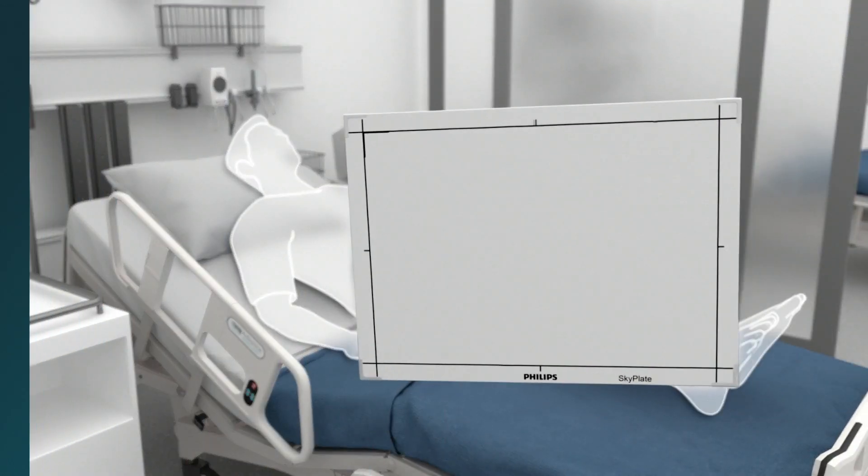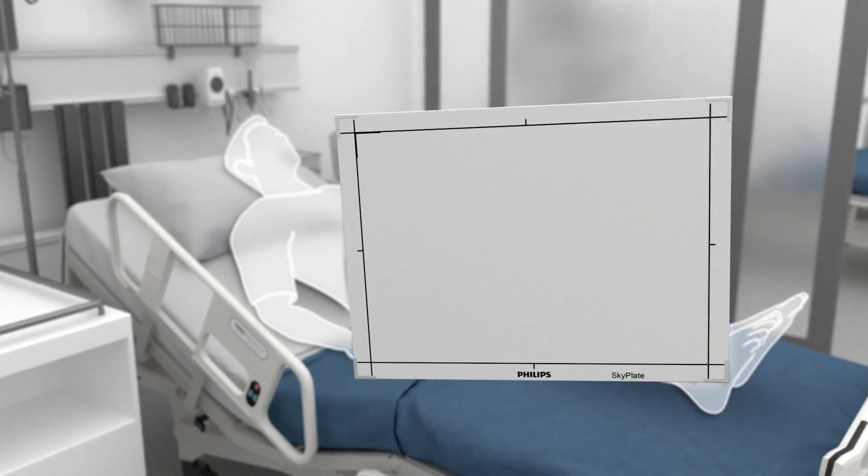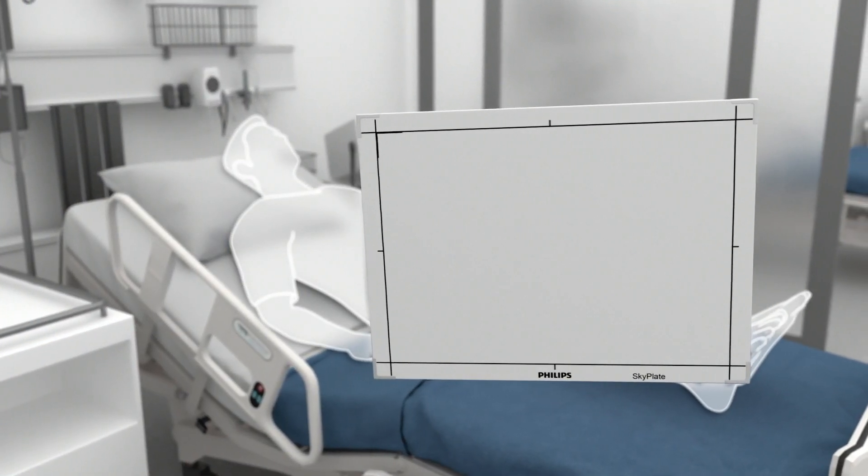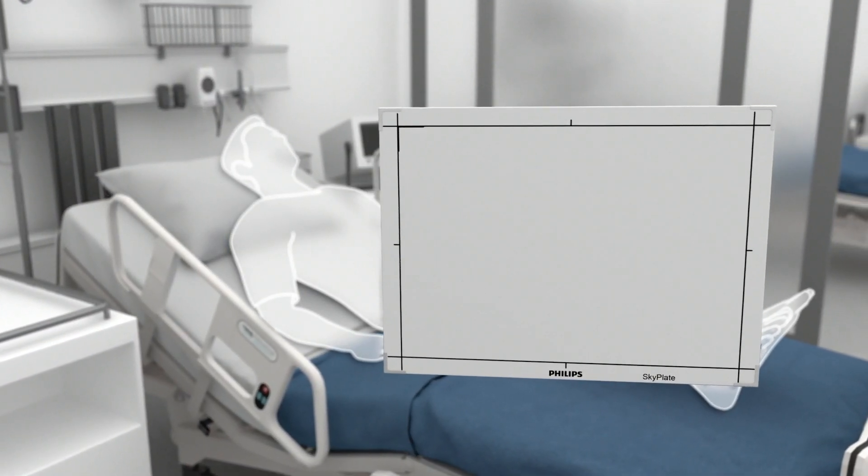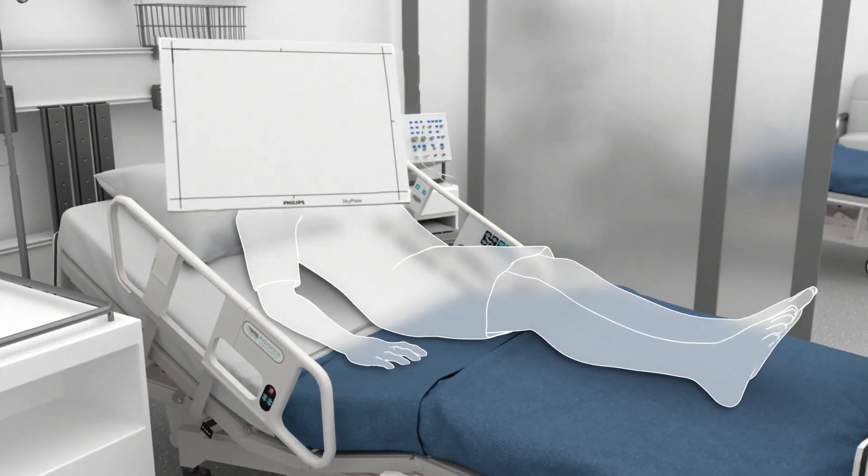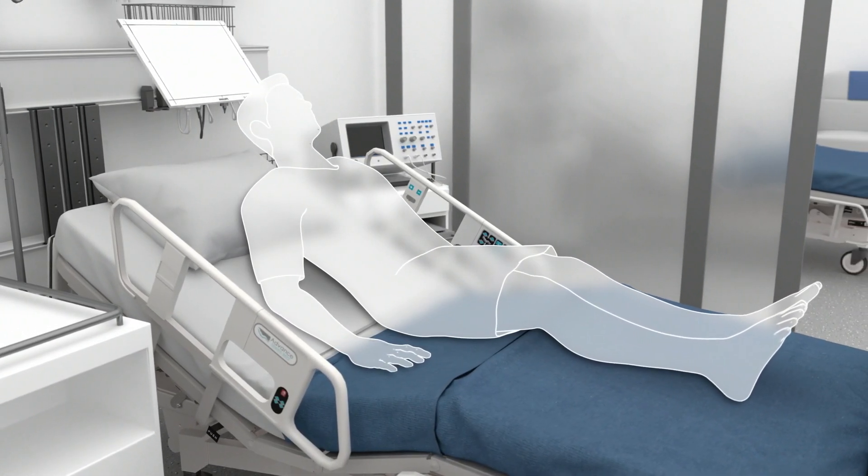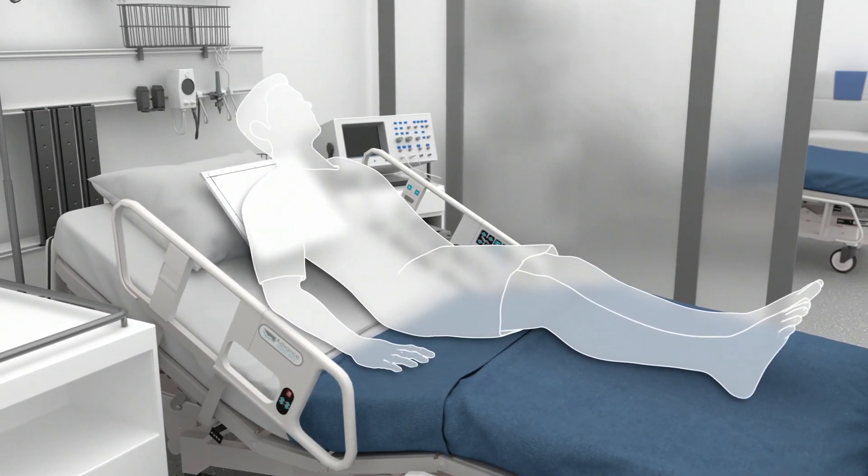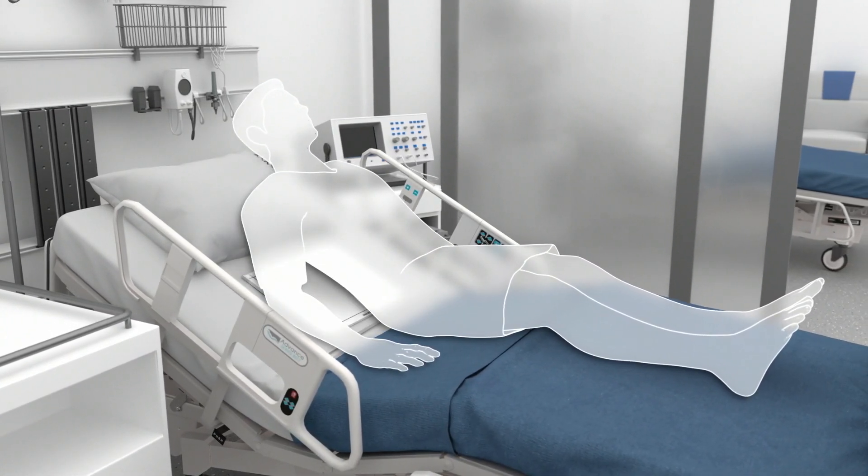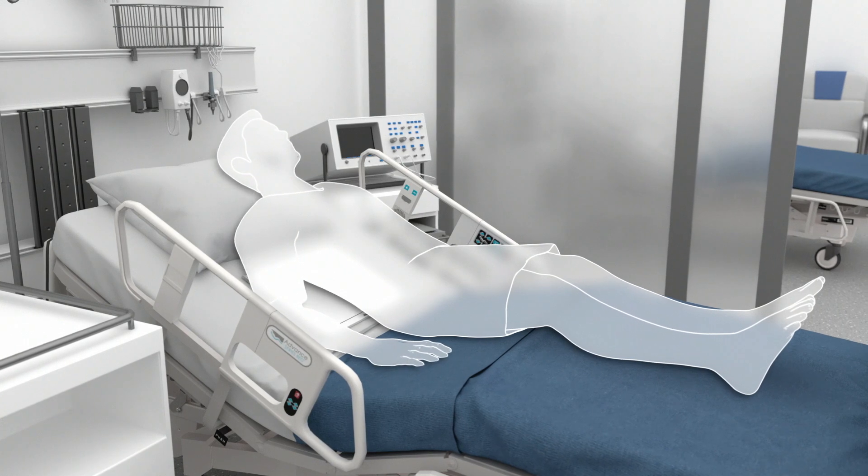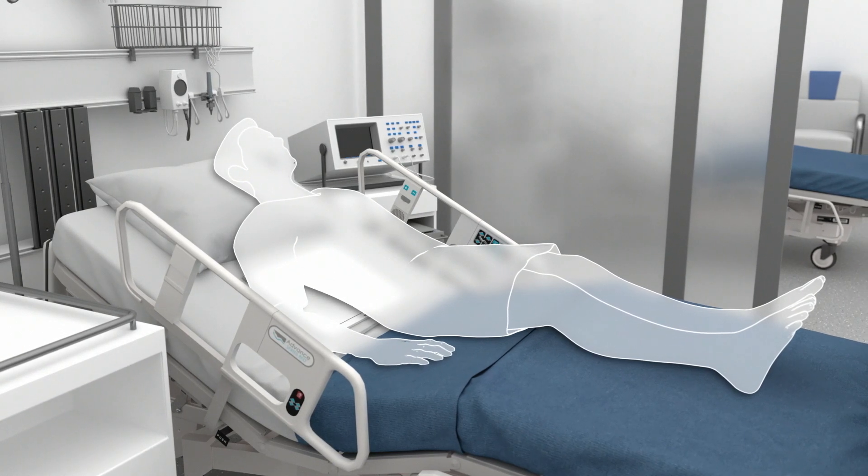When you choose not to work with a grid, SkyFlow Plus scatter correction technology allows you to acquire views of all anatomies without the use of a grid, resulting in quick, convenient exams.